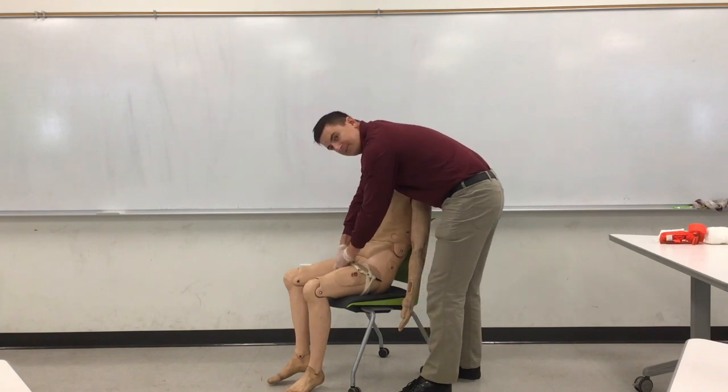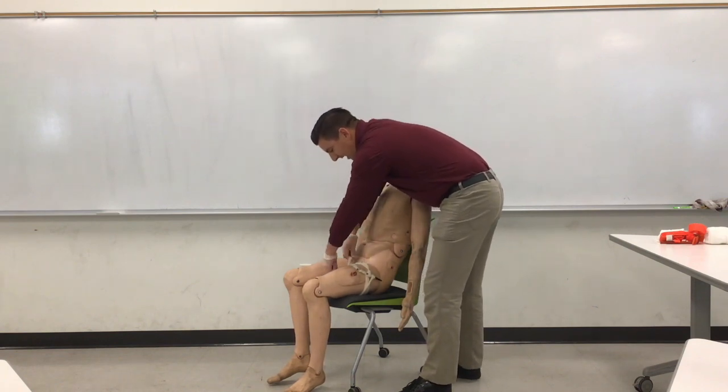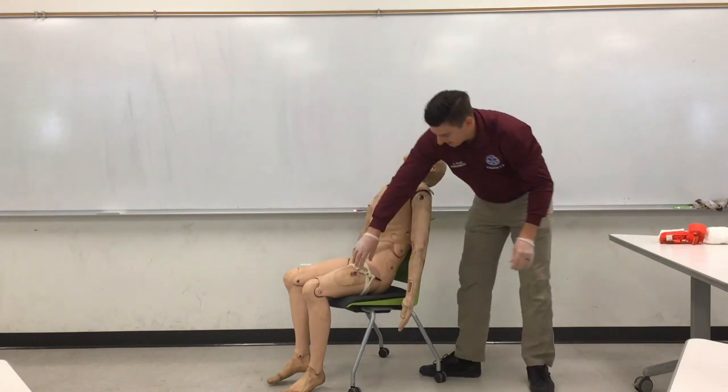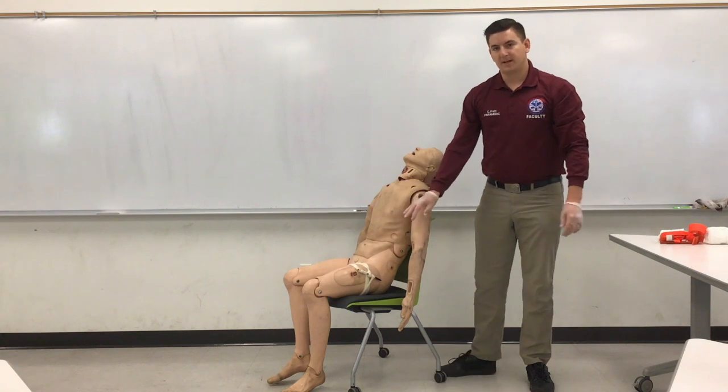I'm going to tie on the opposite side of the leg, or if I have enough slack, tie near the pin so that you can see where the knot is. Okay? My bleeding is controlled.